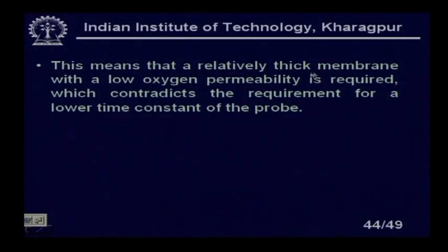This means that a relatively thick membrane with low oxygen permeability is required, which contradicts the requirement, because if you make a thick membrane with low oxygen permeability, obviously the time constant of the system will increase.